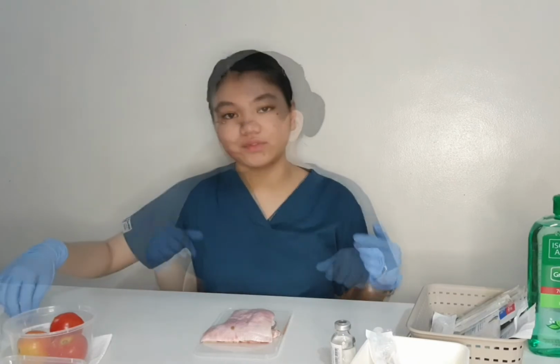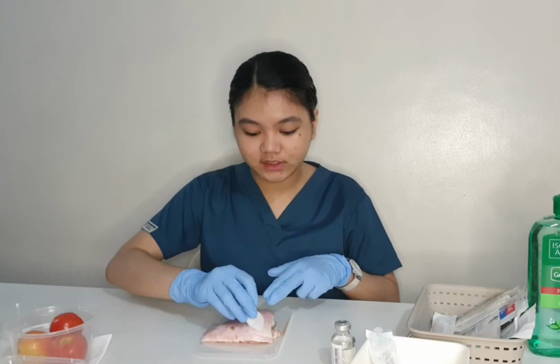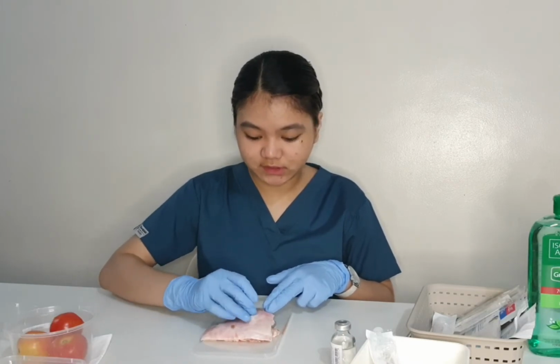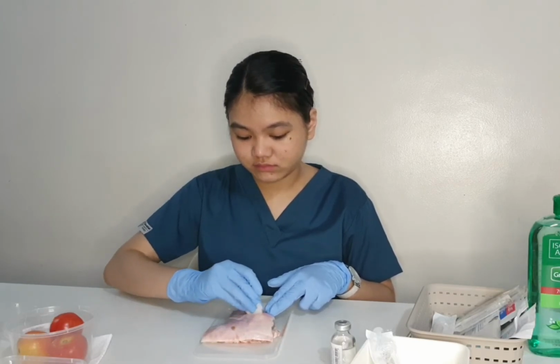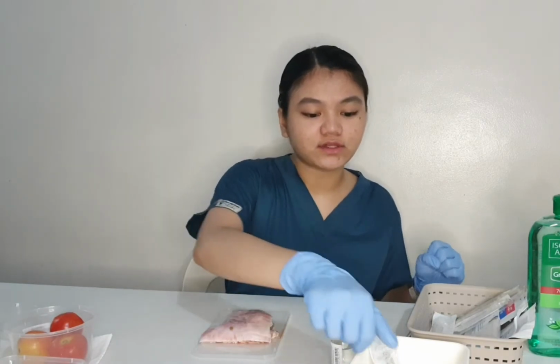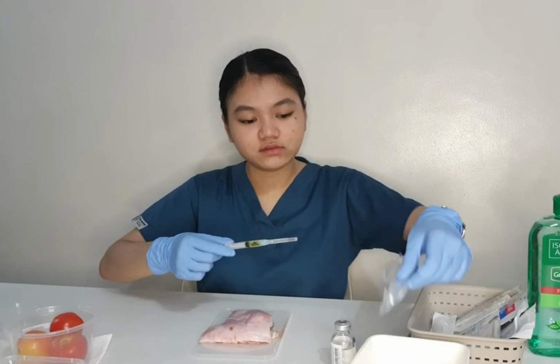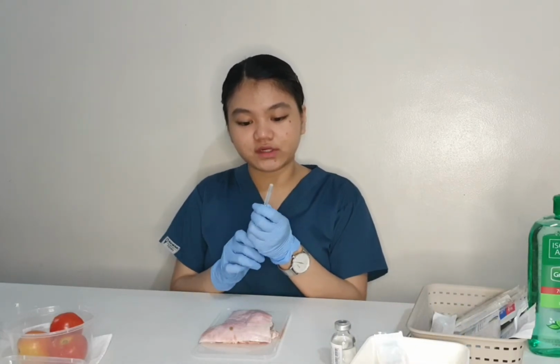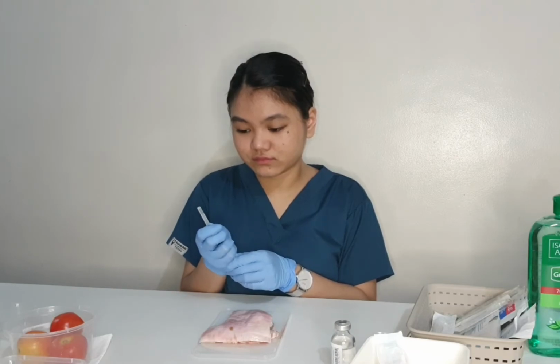Okay, so for now, the next thing we have to do is the subcutaneous injection. So the first thing we have to do before injecting the medication is to clean the area wherein we will be injecting the medication with circular motion. Then throw it. Then after that, let's get the syringe. It's already 23 gauge needle. And let's remove the cover.